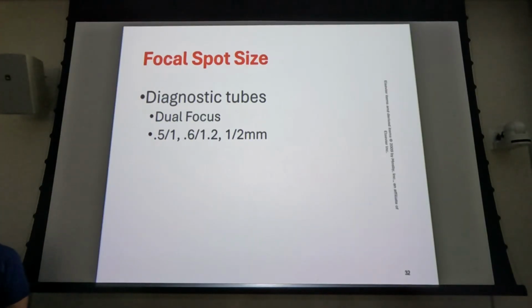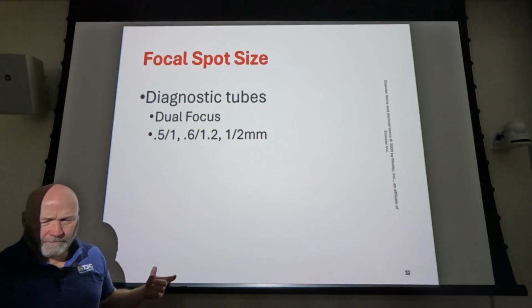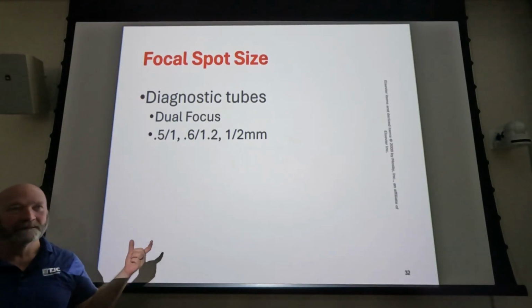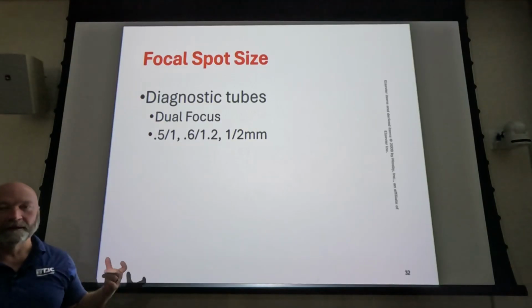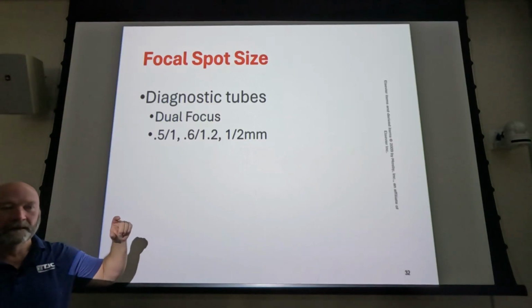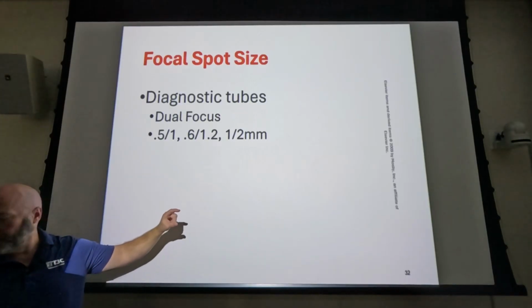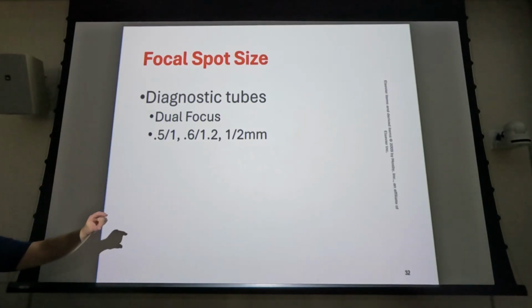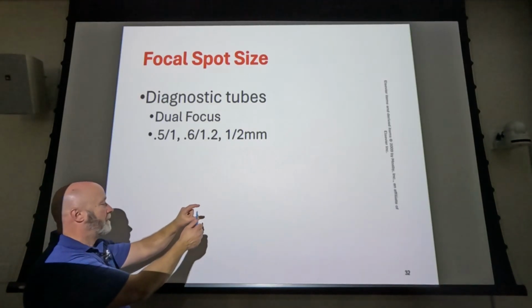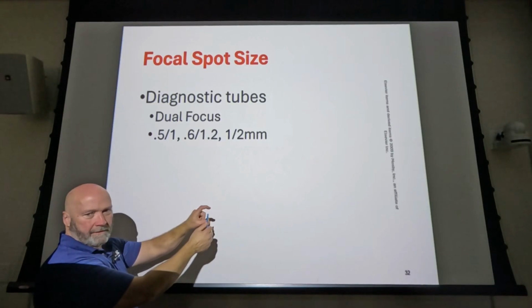Somebody said it, I think. Heat. Yeah, it's heat. We talked about this last semester. We used the tungsten, and let's say you need to cram even 1 mA worth of electrons on a filament that size, and then you've got another filament that is that size. Which one is going to have more heat on it per square inch? The big one or the little one?